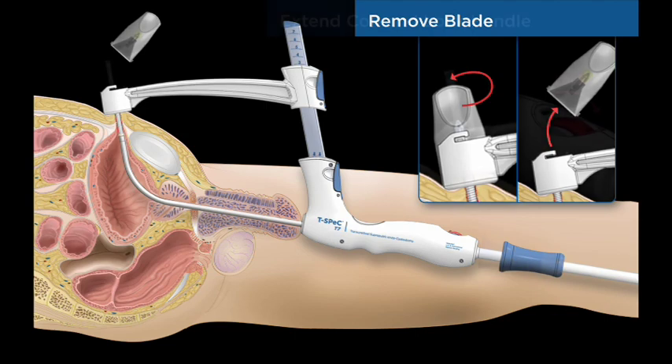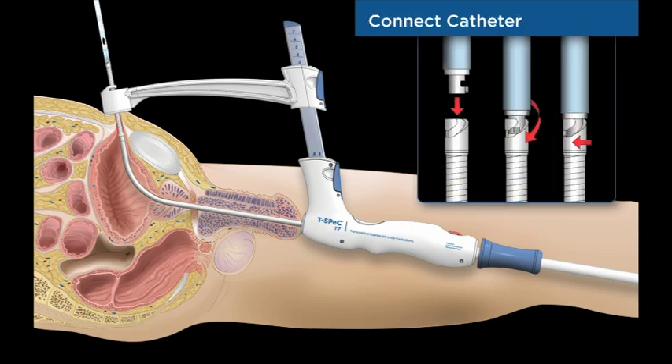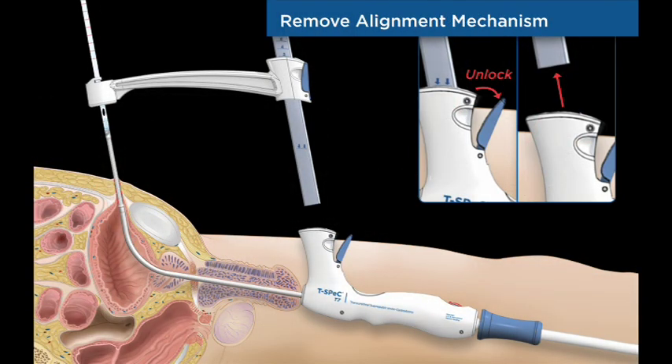The coil and catheter bayonet connector are fully advanced and the handle lock mechanism is engaged by rotating the lock to the rear position. The catheter is attached to the bayonet connector with a simple twisting motion.